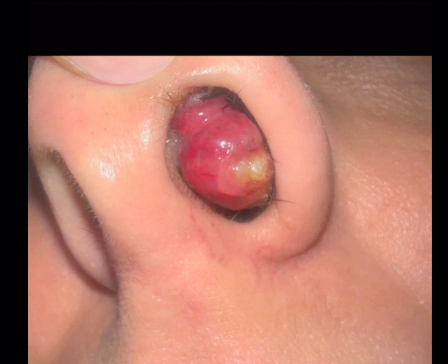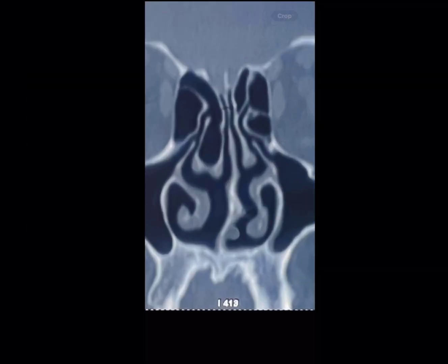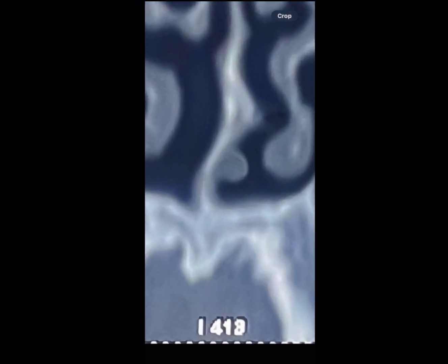Coming back to this particular patient, she is a middle-aged female with only the complaint of left recurrent epistaxis. There was no major obstruction, no facial pain, no facial edema, no snoring and mouth breathing. I did a preliminary scan where you can see an opacity in the inferior part of the nasal septum, and behind that a septal spur of grade 1, and there was an adequate airway. On the right side we can see concha bullosa also.